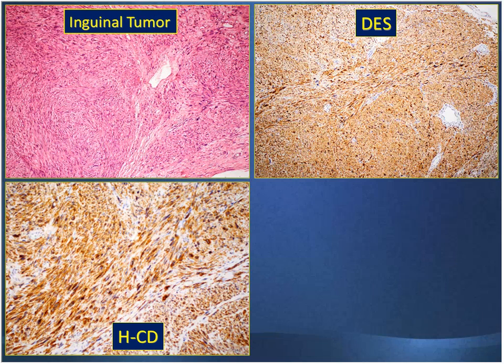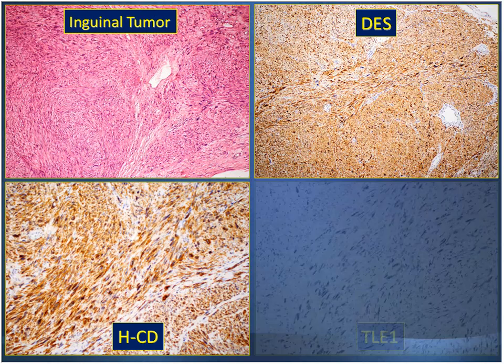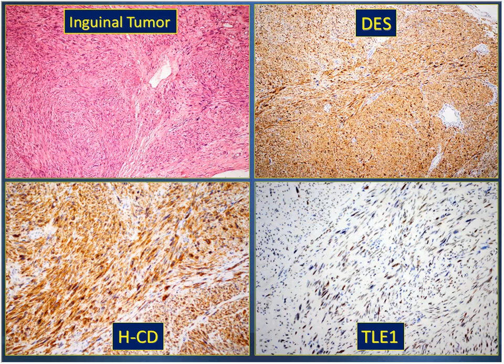So there was no question that this is a leiomyosarcoma in that area. But as you can see, TLE1 is positive in a number of the nuclei of tumor cells, not universally, but a number of them. And of course, that has to be taken into consideration: this particular marker is not truly specific for synovial sarcomas.